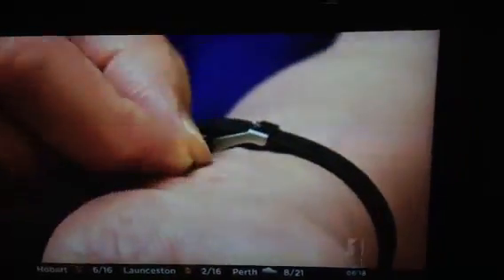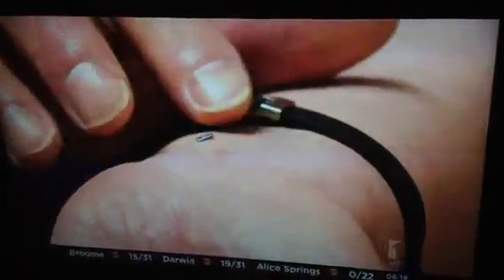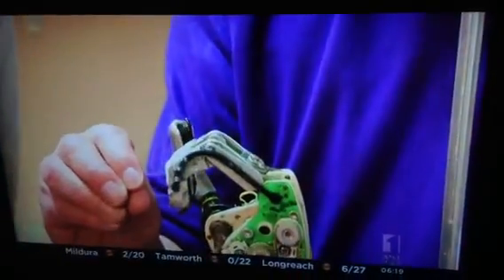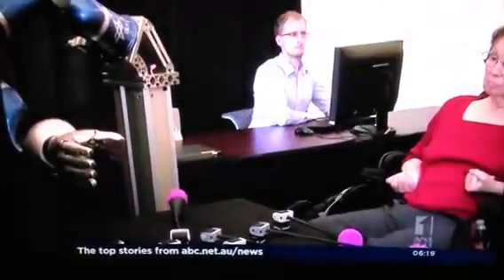This is the implant that I had. This tiny sensor was inserted into the arm of this robotics expert from Reading a decade ago as part of an earlier trial. It enabled him to control a robotic claw. He says the technology could give independence to paralysed patients. This will allow people to do things for themselves, maybe make a cup of tea, certainly switch off lights, open doors, and perhaps even drive themselves around in a wheelchair.